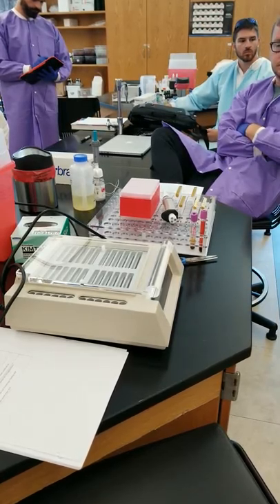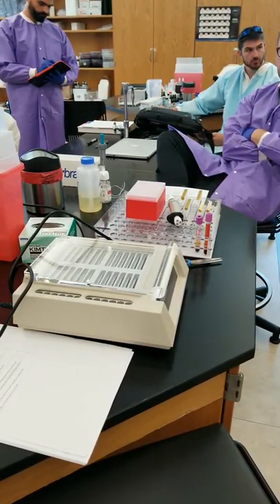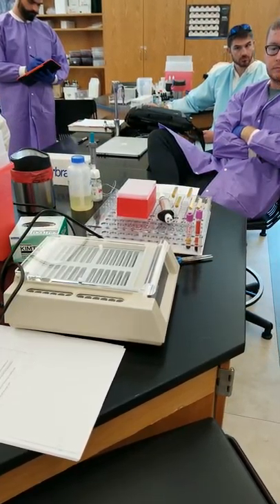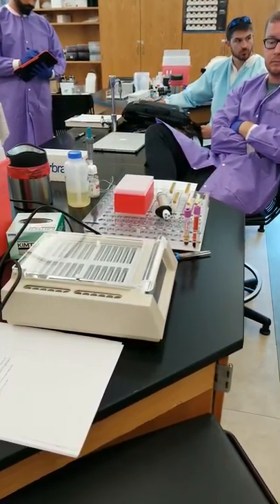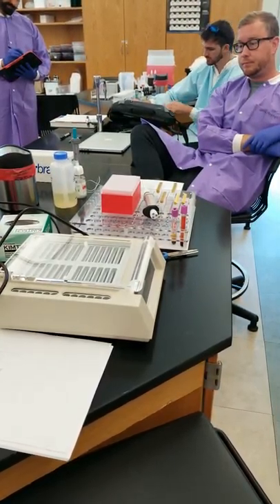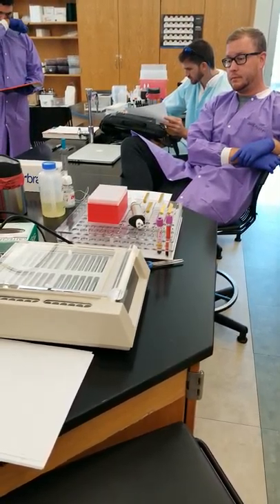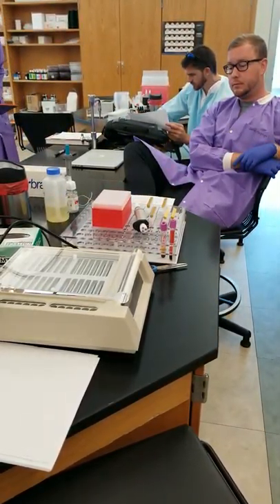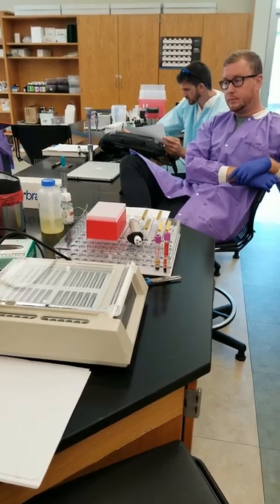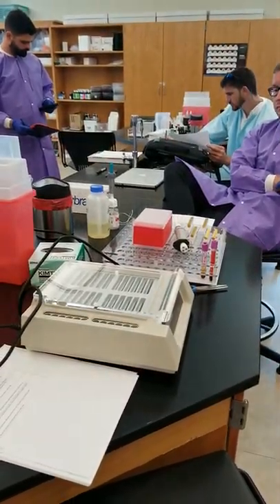Grifols, for instance, has a gel card like these, but it has 8 wells, which I think is kind of funny because you really don't need 8 wells for anything in particular. But you'll see other companies making them now. Once upon a time, you only saw them distributed through Johnson & Johnson / Ortho, but now you'll have other companies with other instrumentation and other gel cards that look similar.